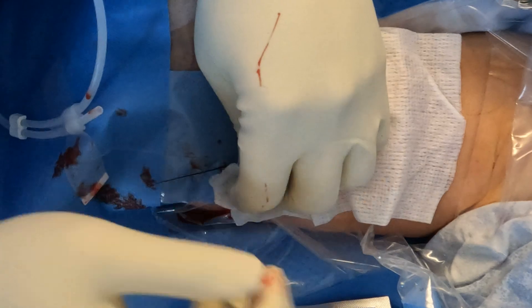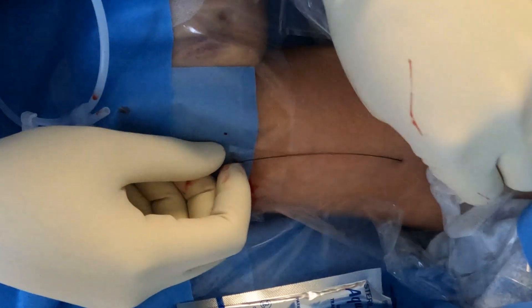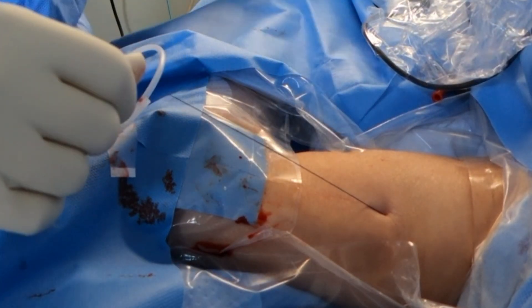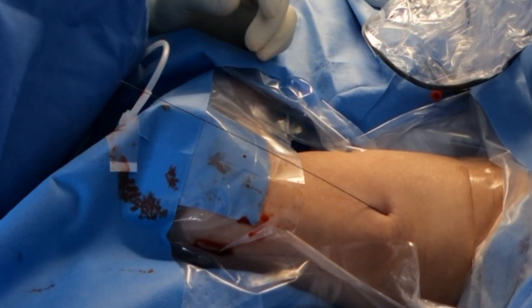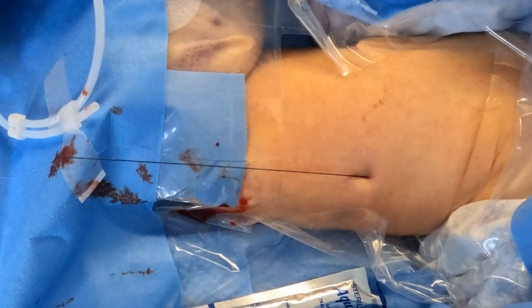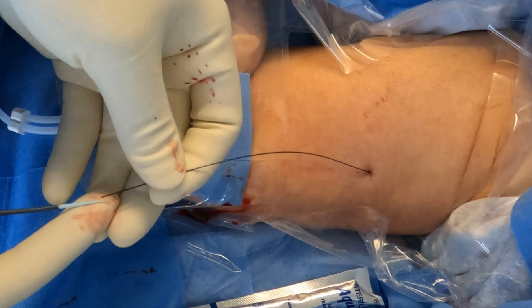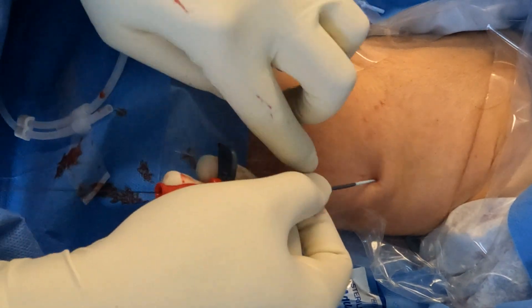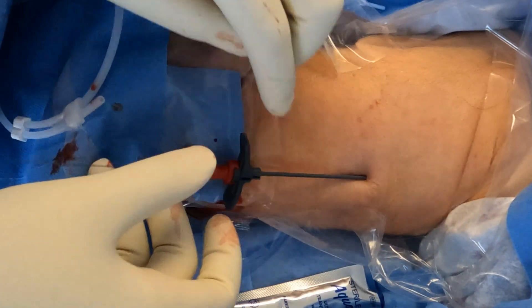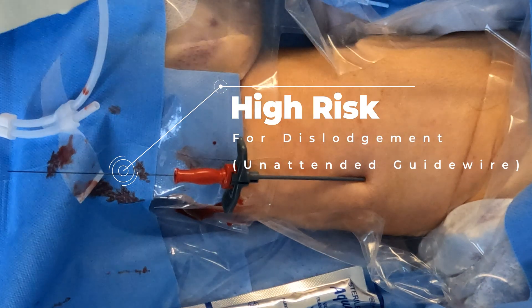At this point I like to remove the gel, because the gel makes it very slippery when I'm trying to apply traction on the skin, especially when I'm trying to shove the dilator through the skin, which can be difficult when everything is slippery. I'm going through the skin pretty well, so I'm going to get the catheter ready.